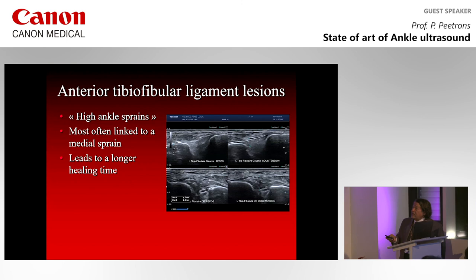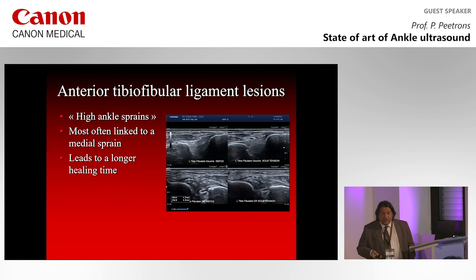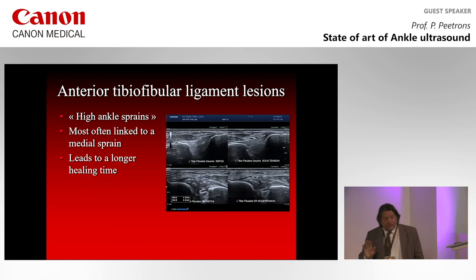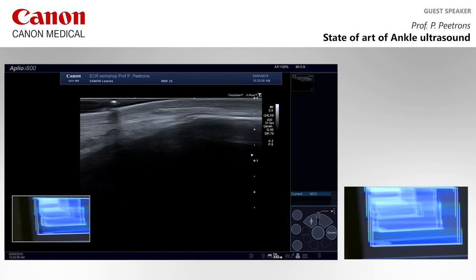I didn't tell you about the anterior tibiofibular ligament lesion. This is a normal anterior tibiofibular ligament, I'm sorry. This is without stretching. This is with stretching. How do you stress this ligament? Do you know? We stress this ligament, I will show you, by doing a dorsal flexion of the foot. Why is it so? It's because we can see this ligament very clearly between the fibula and the tibia, like this. So this is the ligament there.